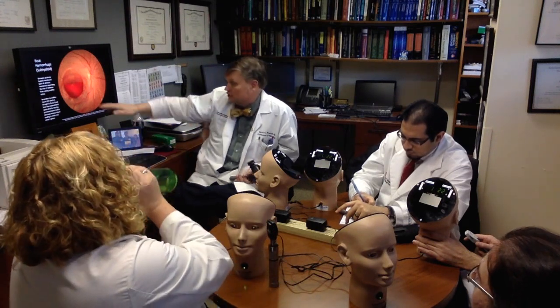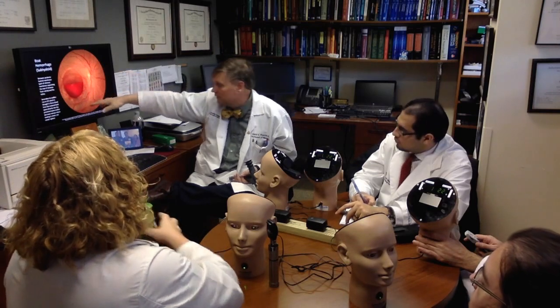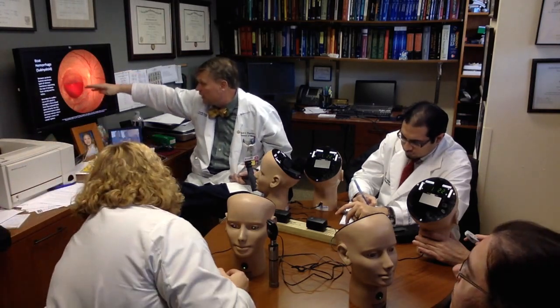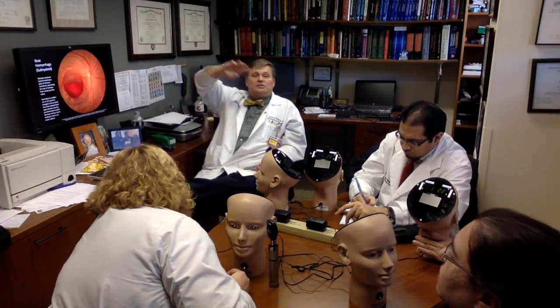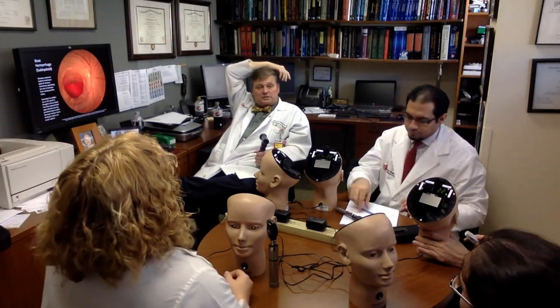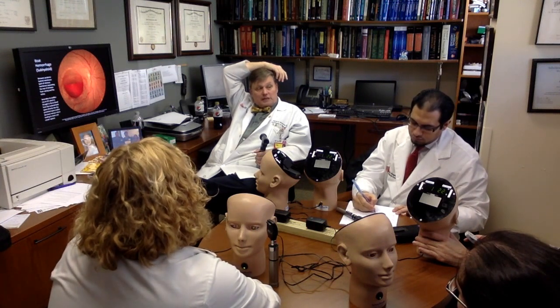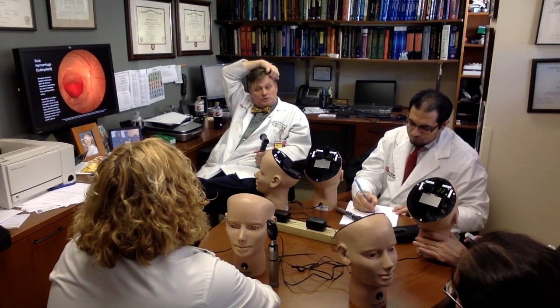All right. So here's a gigantic one, and you kind of get this hematocrit level. You get the layering of the blood cells. So this boat-shaped hemorrhage is really pathognomonic for sudden increased intracranial pressure. You can have it in trauma, obviously, but the most common cause is actually an aneurysm bleeding.